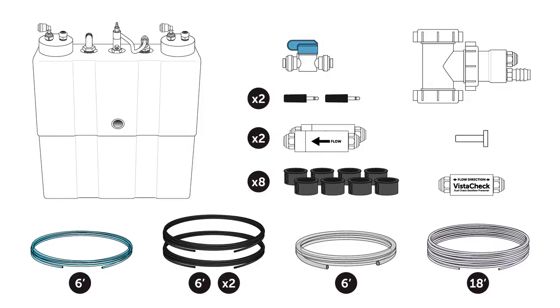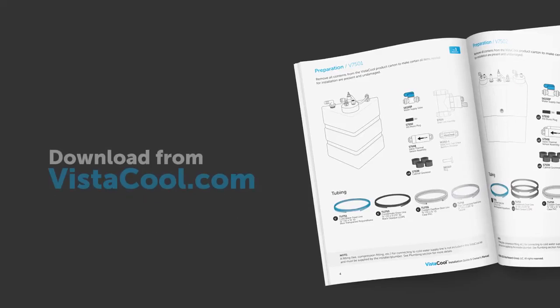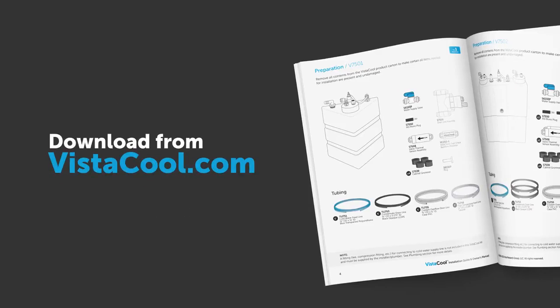Before you get started, remove all the contents from the product carton to be sure all the items you'll need for installation are present and undamaged. You can reference the included installation guide for a complete parts list, or download one from vistacool.com.